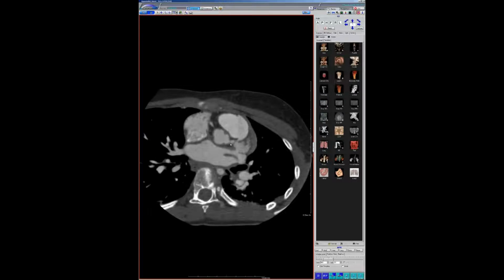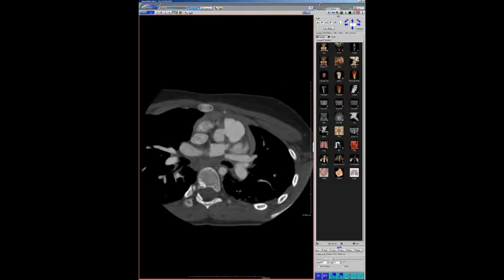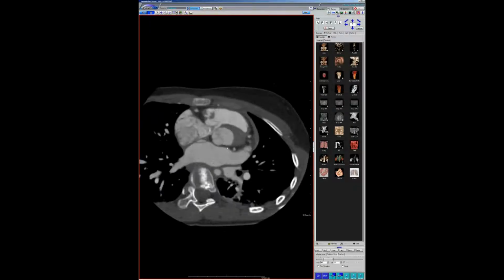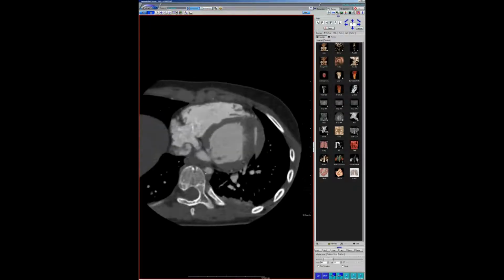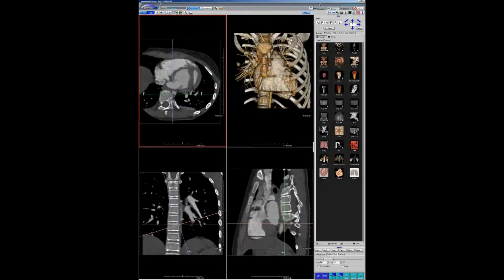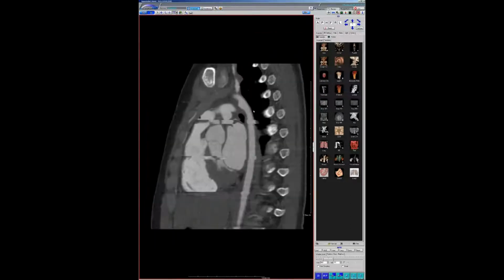You can see there's some abnormal soft tissue around the coronaries as well. And then you can see also that the aorta is just basically small. This is a 12-year-old kid, and this isn't the normal size of an aorta for a 12-year-old, which I think everyone can appreciate. This is tiny, and you can see all these little gating artifacts. You can always tell how many slices a scanner was done on based on the slab difference, right? It should be about 4 centimeters.